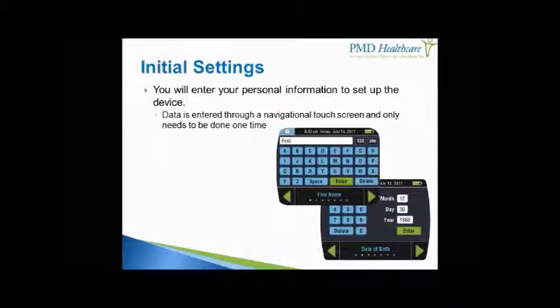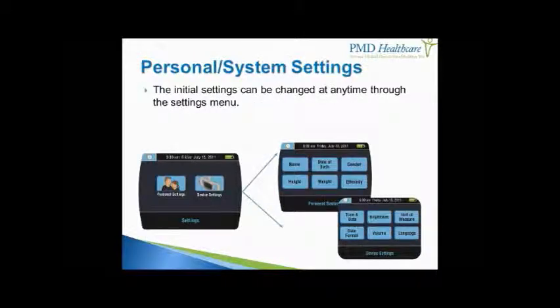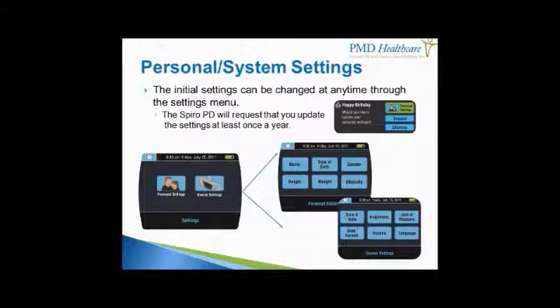When you first get your Spiro PD, you'll be asked to enter your personal information into the device. You'll be guided through entering all of your basic demographics. The initial settings can be changed at any time through the settings menu. And once a year, Spiro PD will wish you a happy birthday and ask you if you'd like to update your personal settings.